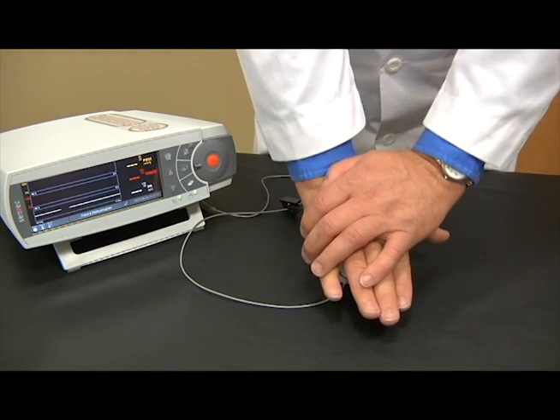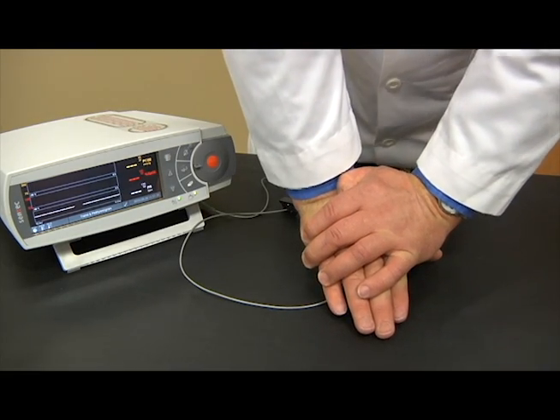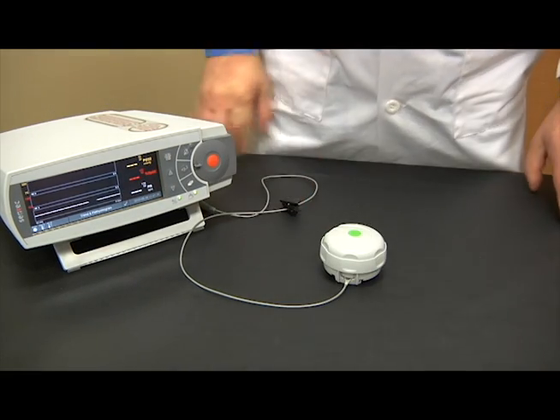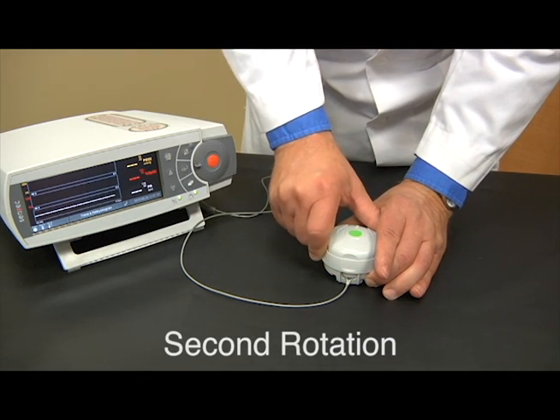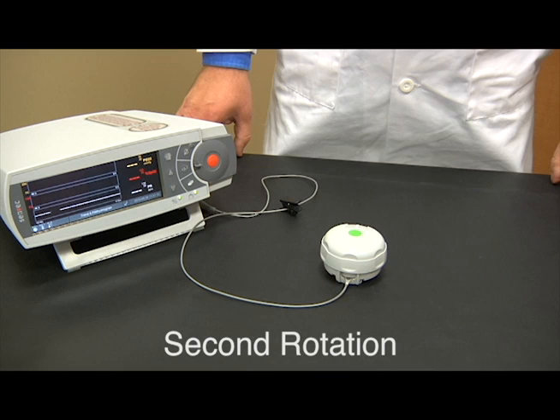Push down on the membrane changer and hold for three seconds. This process cleans the sensor by removing the old electrolyte solution.